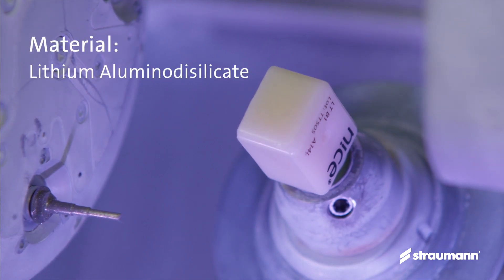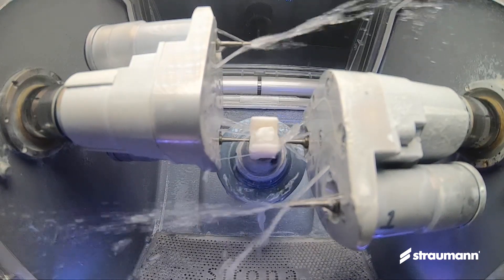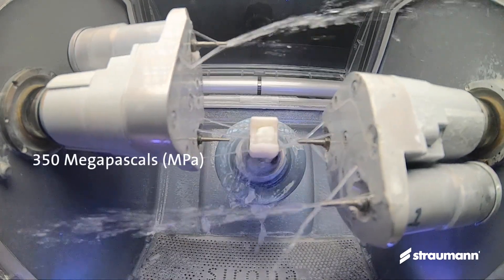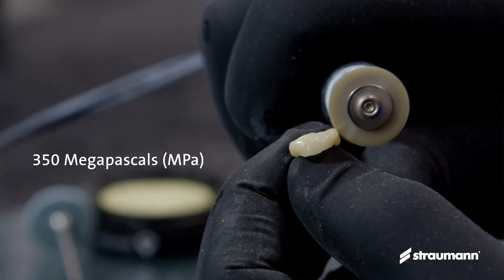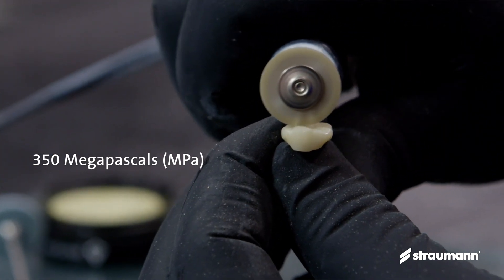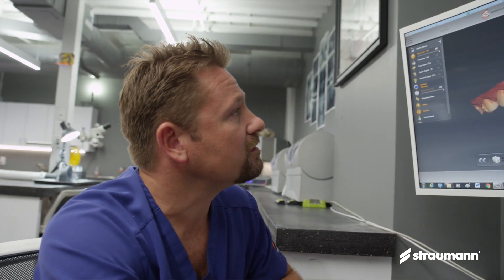The actual material is a lithium alumino disilicate reinforced ceramic. What that allows you to do is mill it at full strength — when it comes out of the mill it's going to be 350 megapascals, which is equivalent to what most blocks are coming out of an oven crystalline cycle.